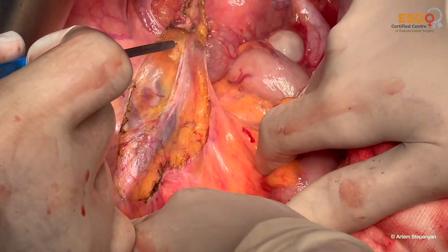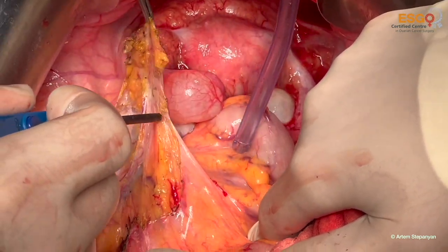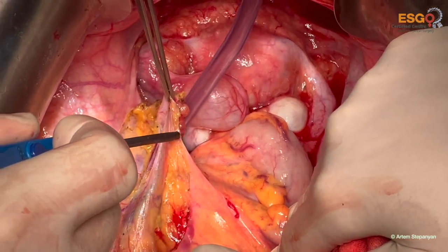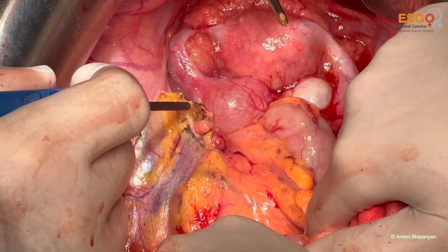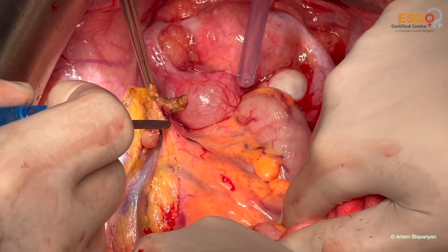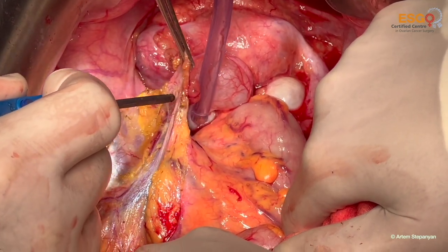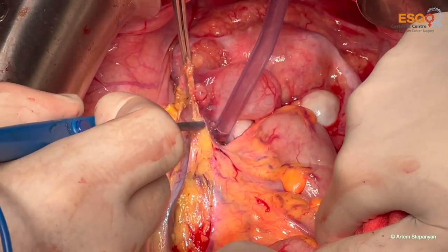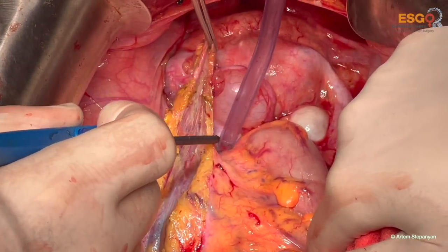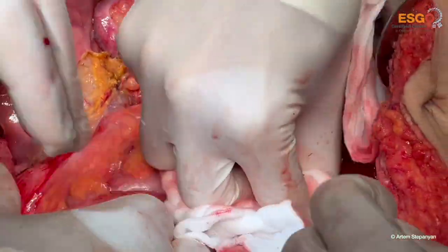At the same time, going retroperitoneally to find the critical anatomical structures. Here you see the IP ligament close to my forceps and to my monopolar. I stripped the peritoneum from it, and gradually going deeper in the pelvis.